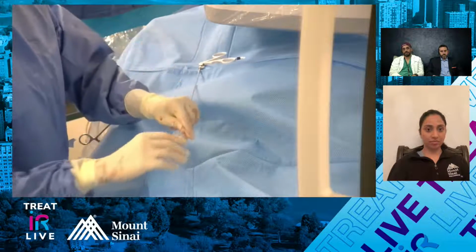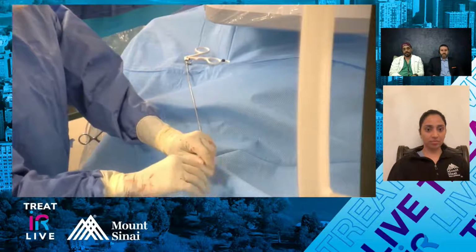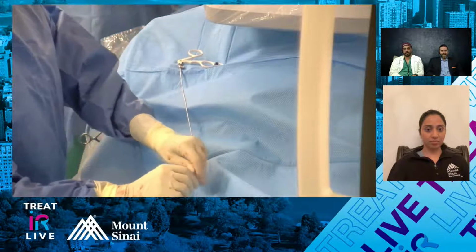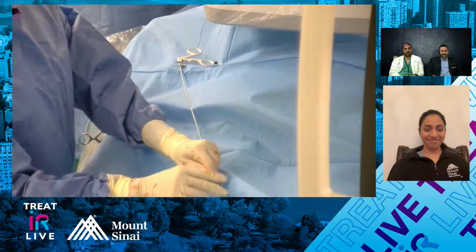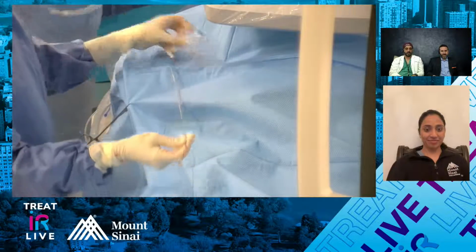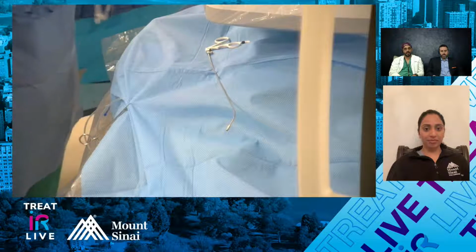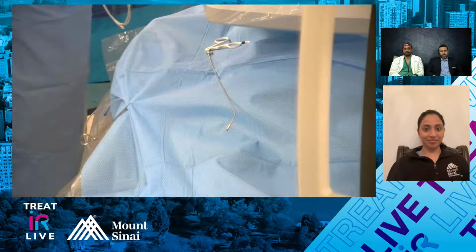Yep, they can be sterilized, so we can use them again. One of the big issues we have right now is don't throw them away, because you can't get them or they're very hard to get. So we have a certain number. They lose their grippiness after a while, so we have a couple that are not as gripped as others.